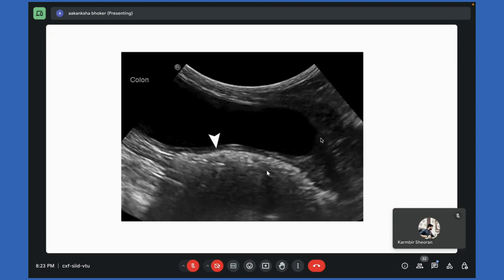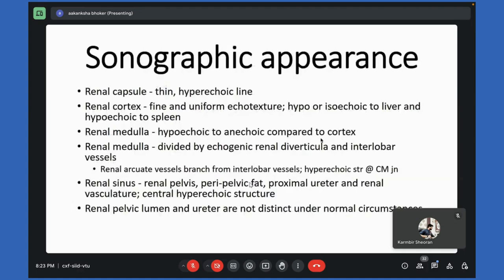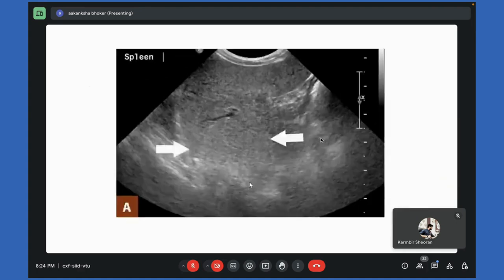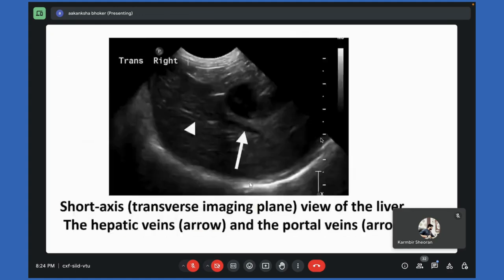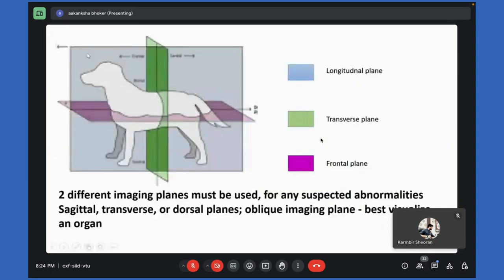Ma'am, how can we visualize transverse and longitudinal sections? See, one thing is view and the other thing is axis. Let me go to that image again. Longitudinal, this is the plane with respect to the animal body. Anytime we place the transducer in this direction, it means we are placing it longitudinally. If we place it like this, we are placing it transversely. And the purple line will be the dorsal scan. So this is with respect to the animal body.